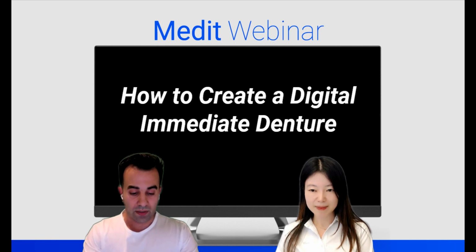The immediate denture, to be honest, during my 12 years of being a dentist, for over 10 years, I stayed away from the immediate denture because we know in dentistry there was one limitation about it, which is we didn't have the opportunity to do a try-in.